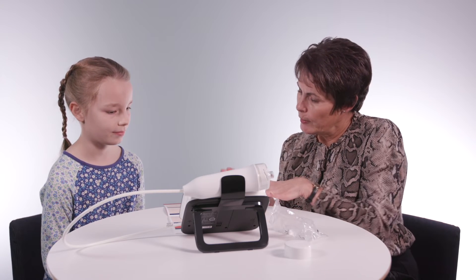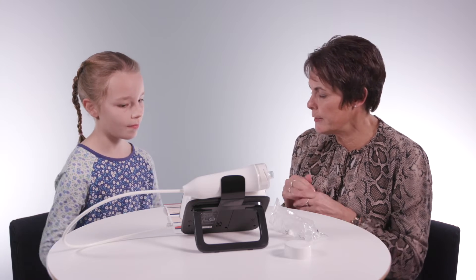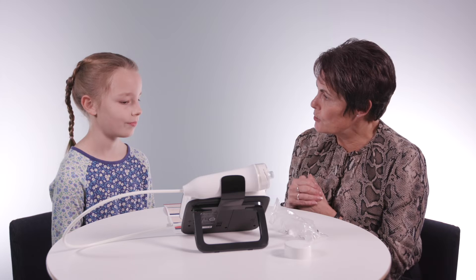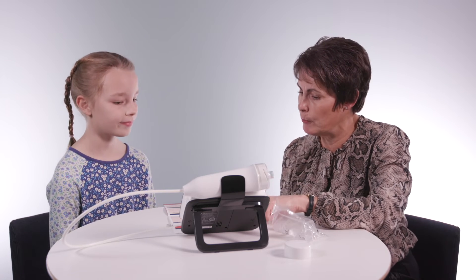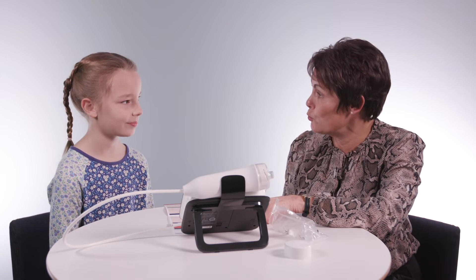So when we get your number, we're going to have a look at this chart, and that's going to help me really make the most of the decision we need to make in order to get you on the right treatment. Now, because of your age, what I'm looking for is a number on here that's less than 20. If it's more than 20, then we know we're going to give you a treatment with an inhaler.